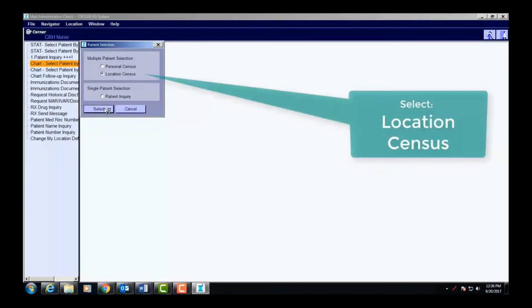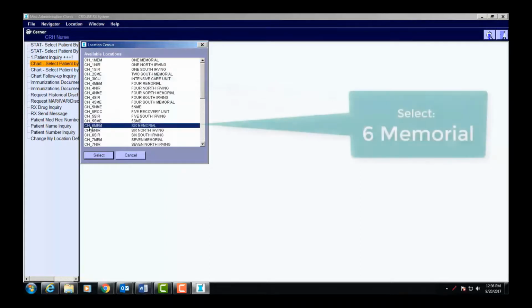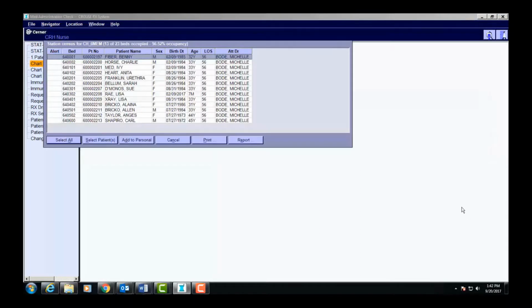Select location census 6 Memorial. Select patient. For this video, we will give medications to Benny Fiber. Left click on his name to highlight and then click Select Patient.